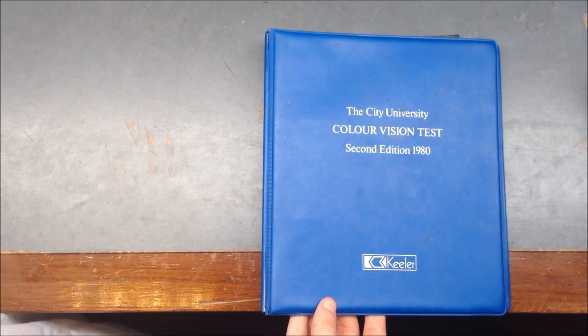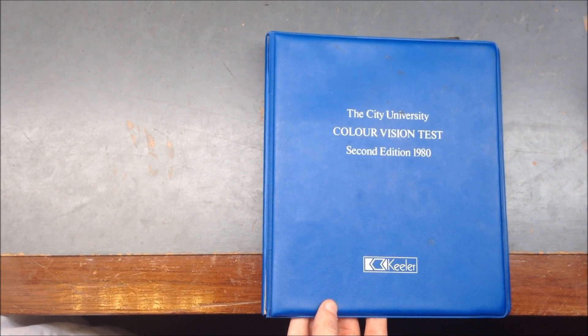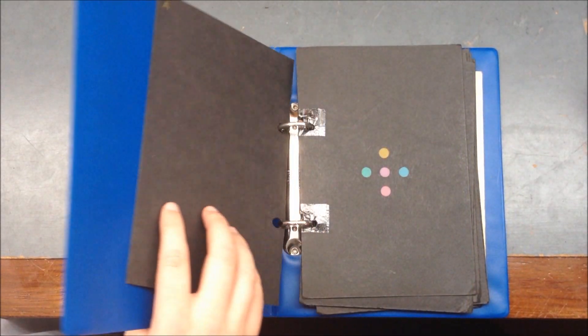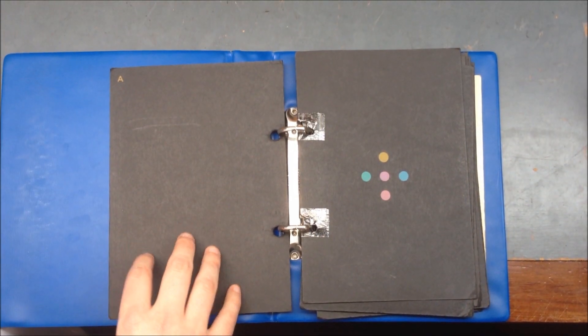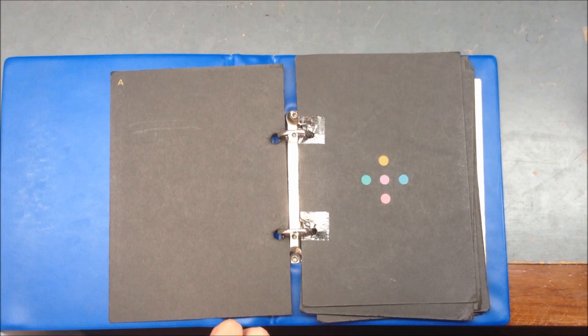This is the second edition of the City University test and it's derived from the D15 test. In each test there are 10 plates, each displayed with a central color and four peripheral colors.